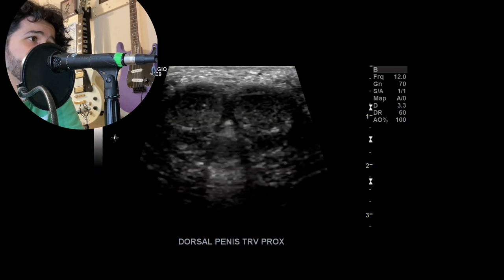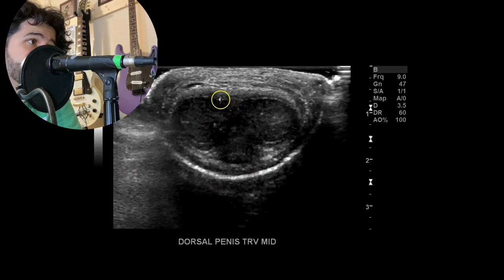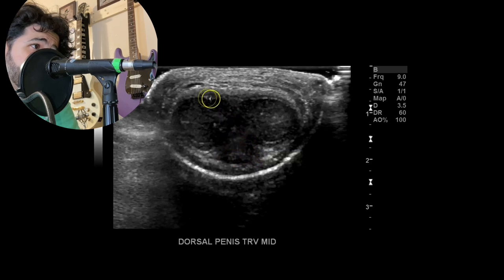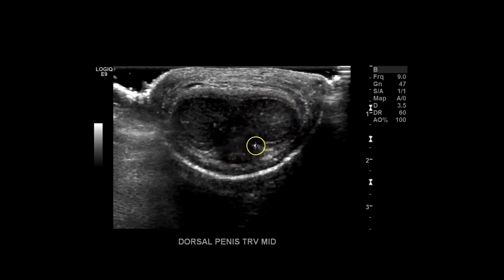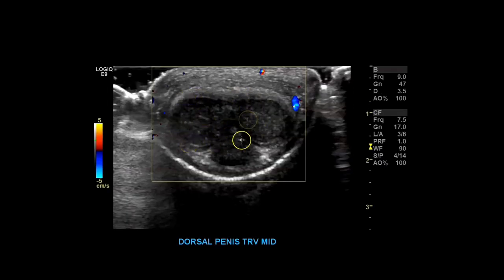Then we go to dorsal penis transverse mid. Again you can see the corpus cavernosum on either side — right side here, left side here — and then the corpus spongiosum. As you may or may not know, the fibrous covering of the corpus cavernosum is the tunica albuginea, so you want to make sure that's intact. Take a couple pictures at mid. With color doppler it kind of looks like a praying mantis. This is the dorsal aspect of the penis; the ventral aspect is below, and the testicles would be down here.